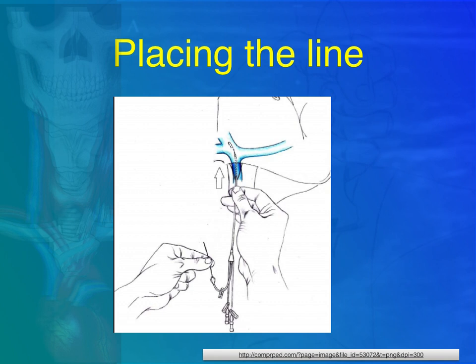There are many cases where this wire ends up inside the vessels of the patient, and then you will become famous or infamous with the vascular surgeons and the IRs, who are the ones that will take the wire away. So remember, always control of the wire.